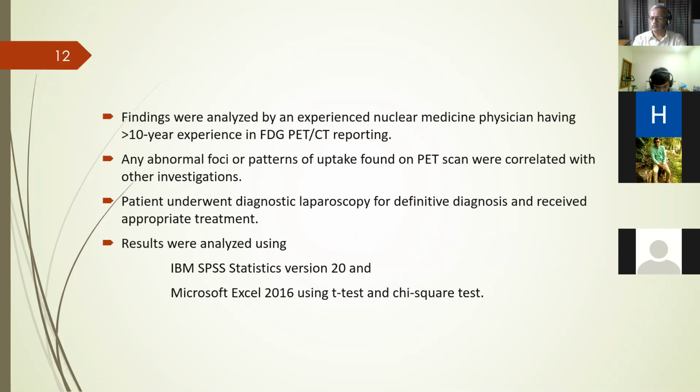The FDG PET reports were analyzed by a nuclear medicine physician having more than 10 years of experience, and any abnormal foci or pattern found on PET-CT were correlated with other investigations. If clinically significant, the patient underwent diagnostic laparoscopy to find a definitive diagnosis and give appropriate treatment. The results were analyzed in IBM SPSS Statistics version 20 and Microsoft Excel 2016 using t-test and chi-square test.